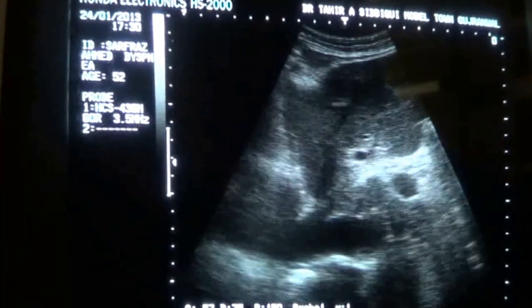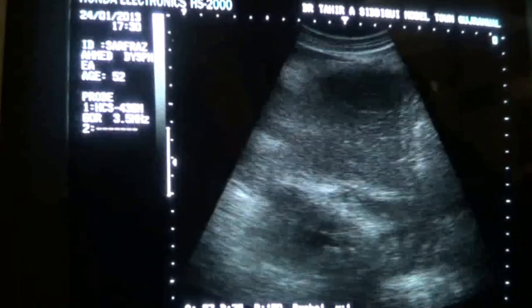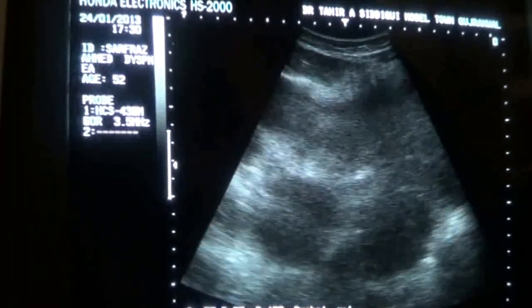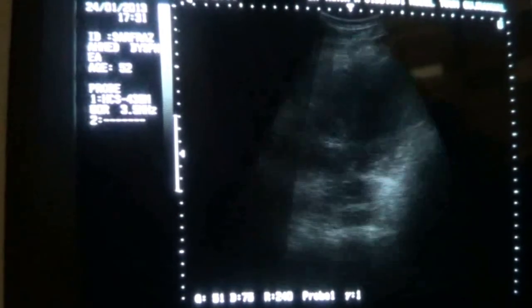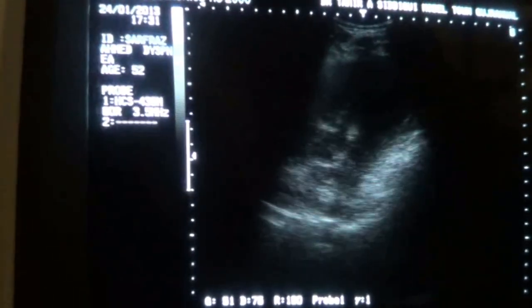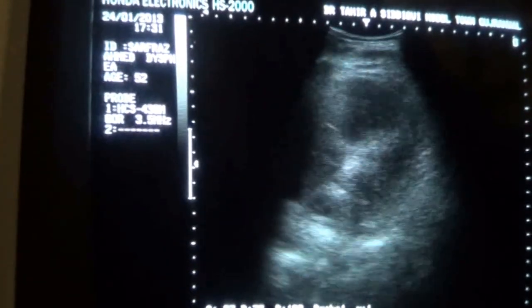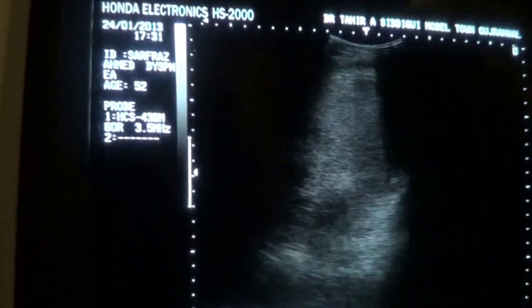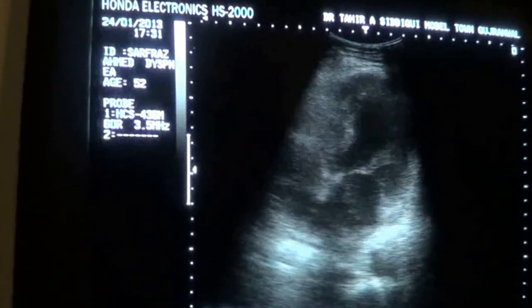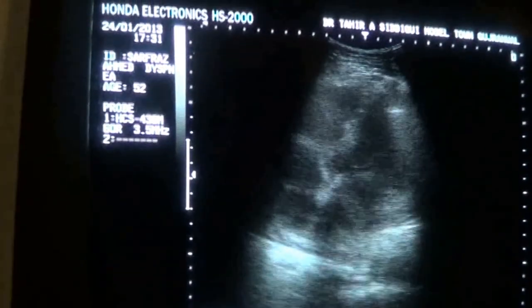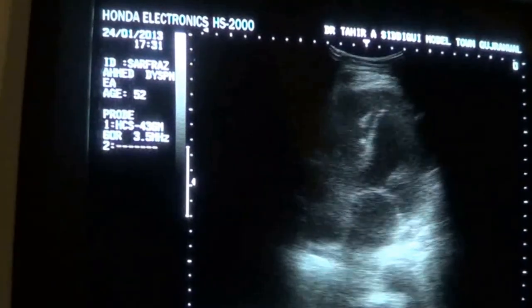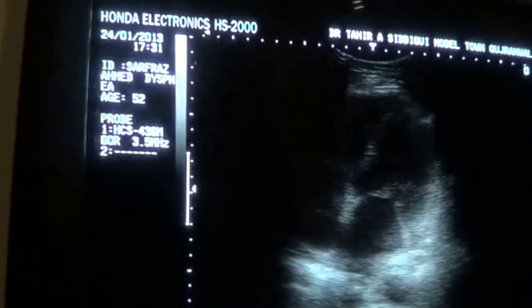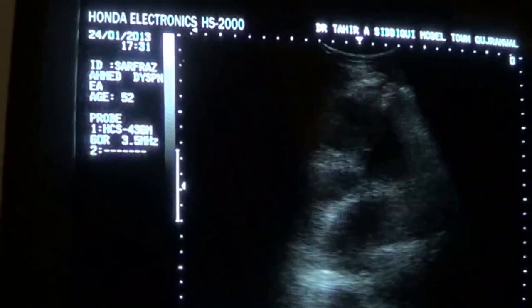This is the left hepatic vein. If I see subcostal, I see the heart is dilated — all the chambers appear to be dilated in the subcostal view. Now I am in the intercostal segment, and you can see the dilation of all the ventricles.